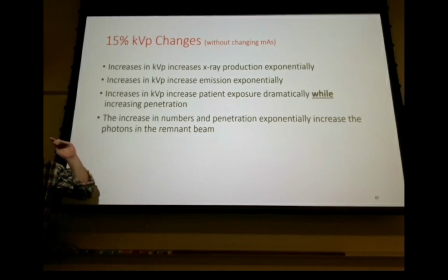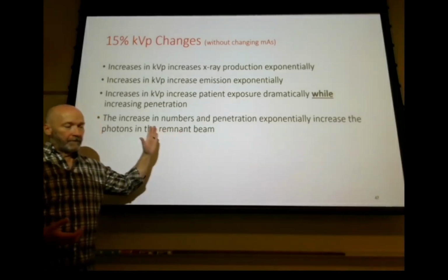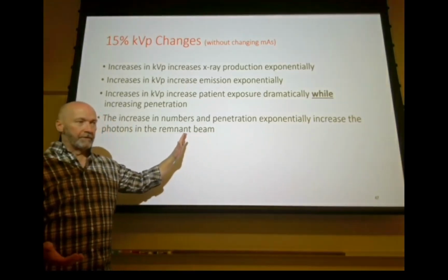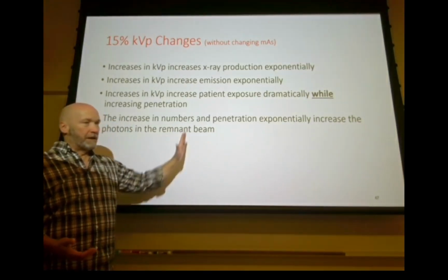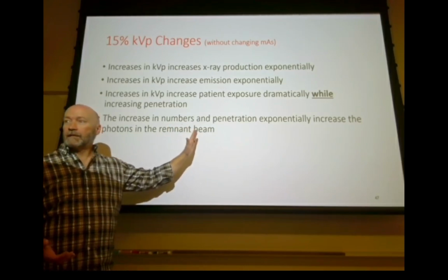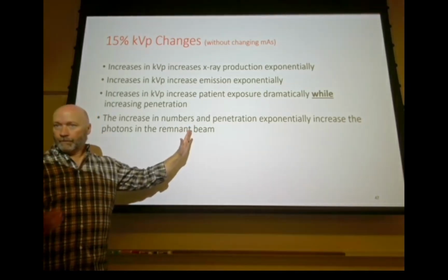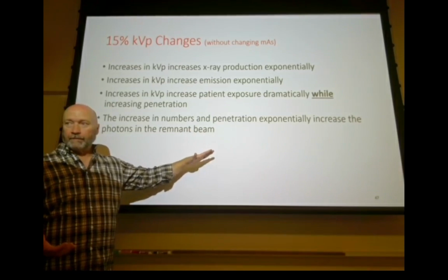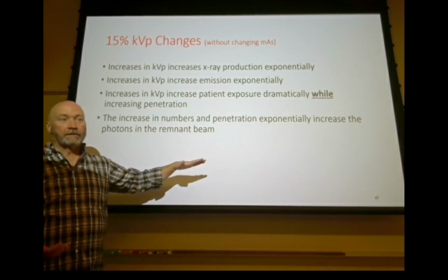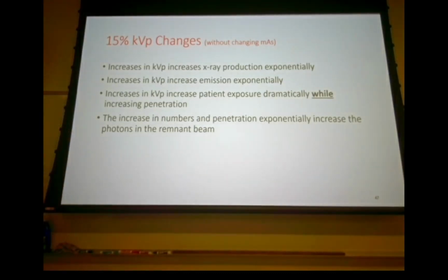and thinking about the characteristic curve, just using it for an example, if we shot a set of ribs with 75 kVp, then we would have high contrast, as opposed to if we shot a chest x-ray with 120 kVp, it'd be more horizontal, right? High contrast, low contrast. kVp controlled our contrast. All right?